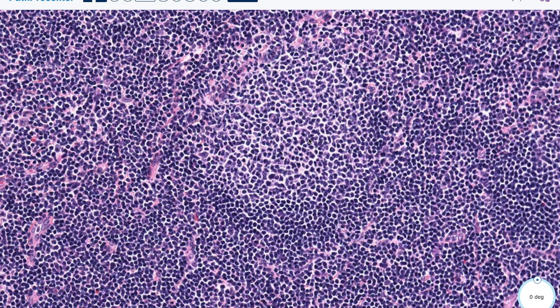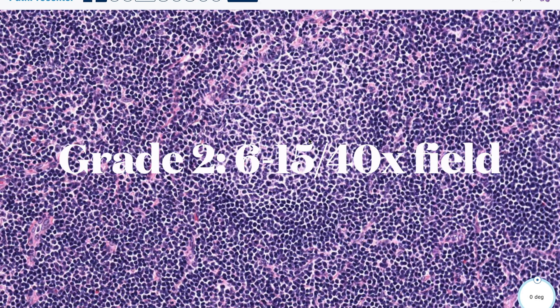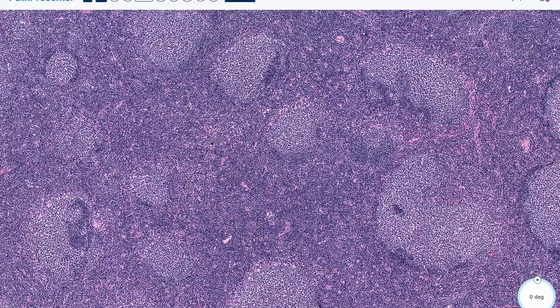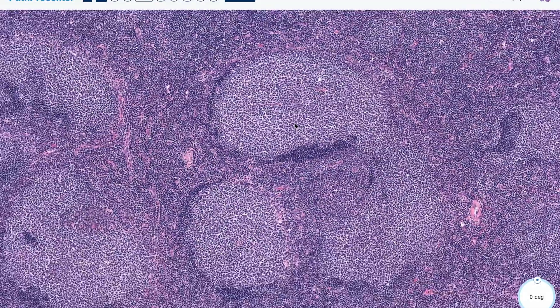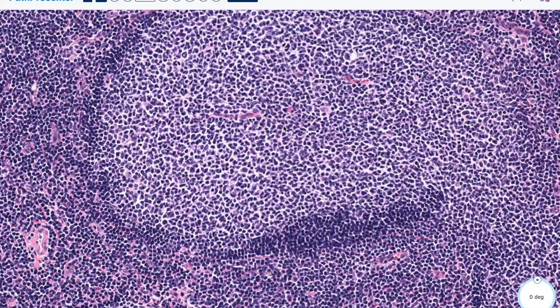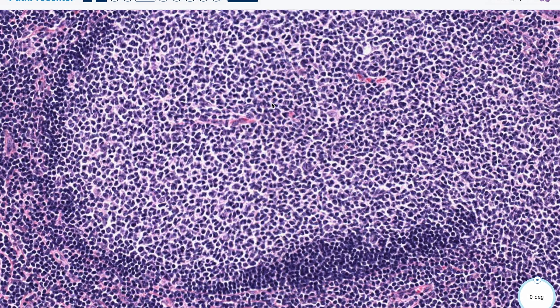If you saw between 0 and 5 centroblasts in a 40X field, that would be grade 1. If you saw 6 to 15 centroblasts, that would be grade 2. Grade 1 or grade 2 is considered low-grade follicular lymphoma. However, if you saw more than 15 centroblasts in a 40X field, that would be considered grade 3 follicular lymphoma, which is more of a high-grade follicular lymphoma.